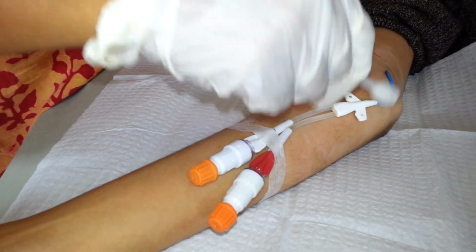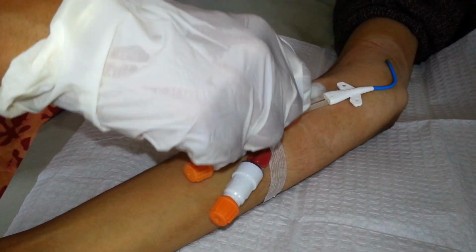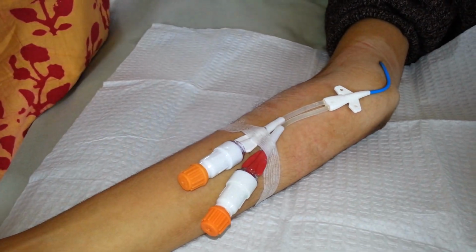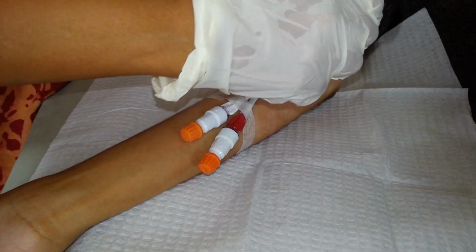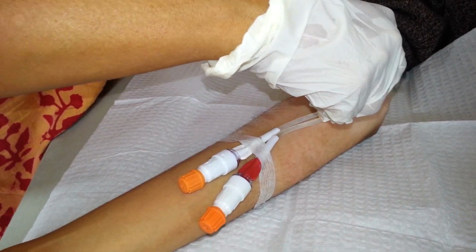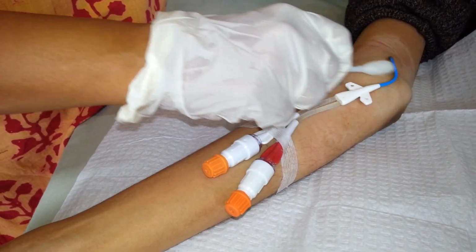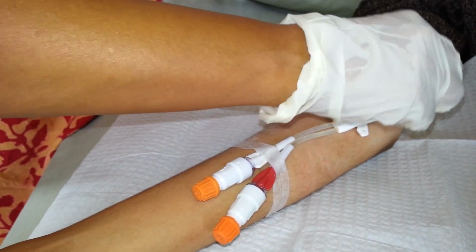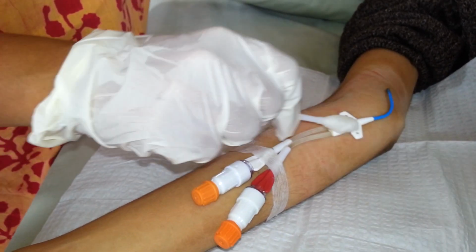We also clean along the length of the catheter because it tends to deposit skin debris that should be removed. We repeat the same steps with 2 other swab sticks. Watch the motion carefully as we move the stick in a spiral motion. Again, it's not circular, it is spiral. The idea is not to put the stick back on the point that has already been cleaned.